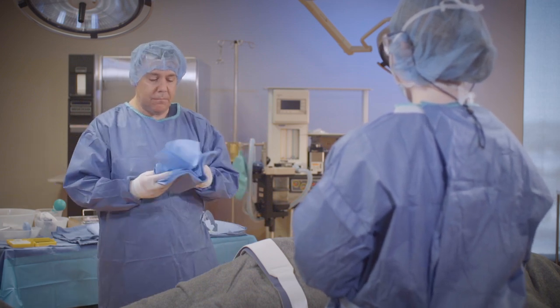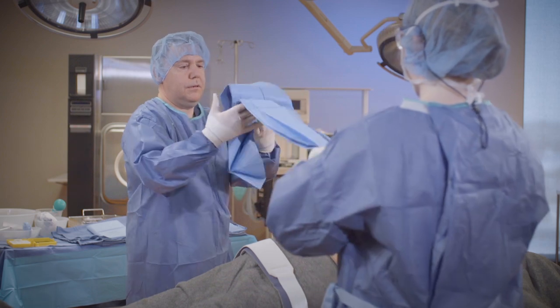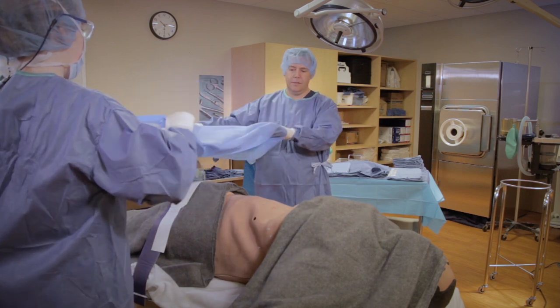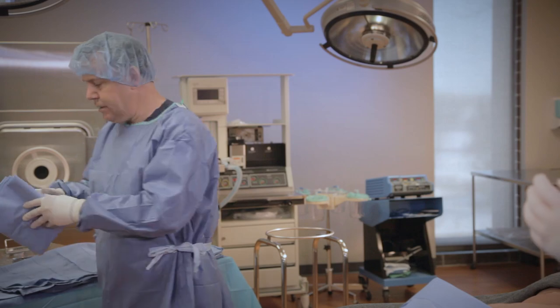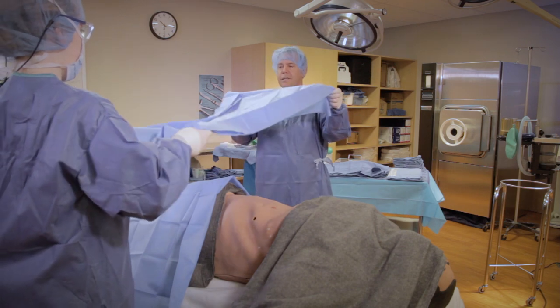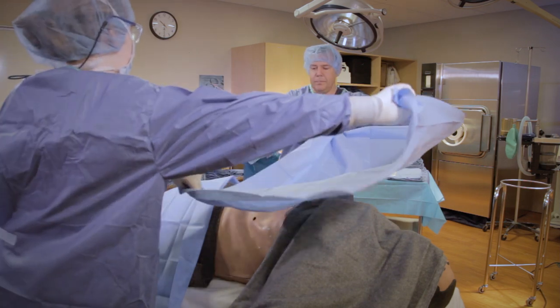I am going to bring my medium sheet up, pass half of it to the surgeon, and we are going to drape the inferior patient. We are going to extend, make a cuff, and drop. Next medium sheet I am going to give to my surgeon, we are going to unfold it, extend it, make a cuff, and place it superiorly. I like to do this first because it covers most of the patient and helps cut down on contamination.